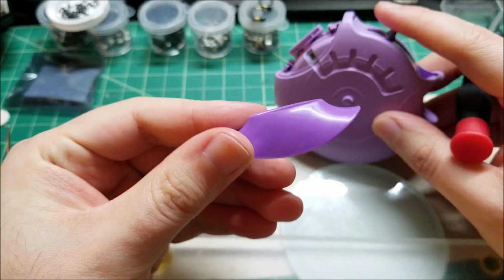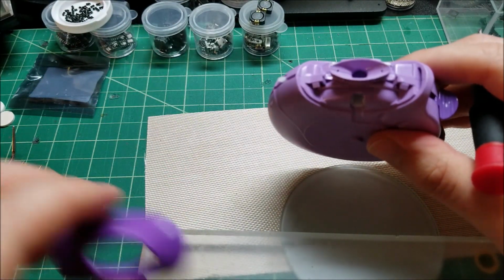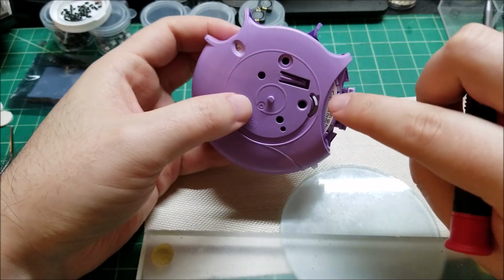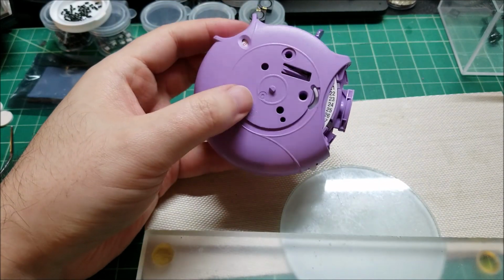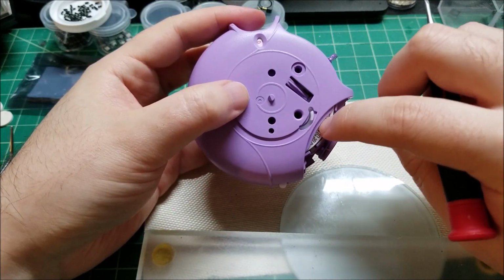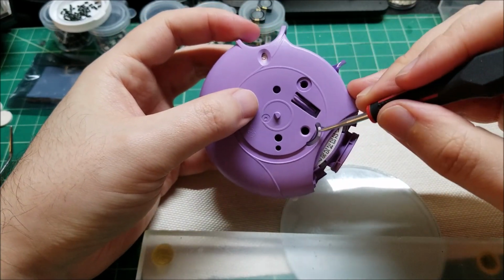And this is the mouthpiece. As you can see, it just has a ridge that seats into this cutout here, and that's all that's holding it in. Beyond that, you can start to see that number wheel, and it goes all the way around. I'm guessing there's maybe 50 doses or something like that. But anyway, it's basically a semicircle, very similar to the calendar wheel on an analog watch. You can see that's just basically a little disc mechanism. As I jiggle it, you can see the number moving in the window as well.